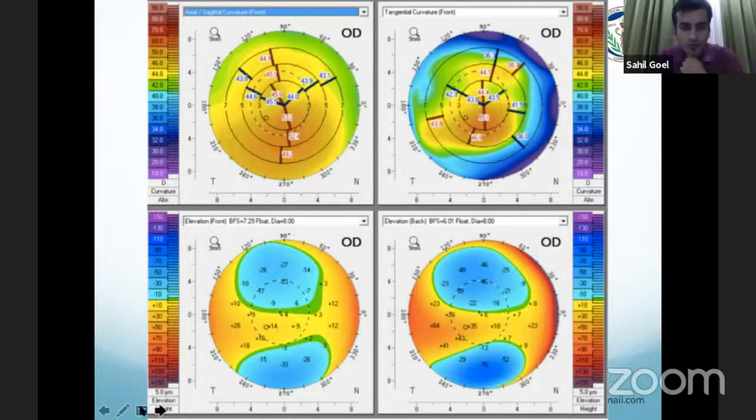So the cutoffs used, say, generally in Pentacam, would vary from machine to machine. Generally, the cutoffs used in Pentacam for the anterior best fit sphere would be 15 microns, for the posterior would be 20 microns. Pentacam and Galilei probably differ in this way: Galilei generally advocates in its indices that the toric aspheric is a better reference surface, that it increases the sensitivity to pick up keratoconus, while Pentacam essentially relies on the best fit sphere, or, as I will be showing, an enhanced ectasia reference surface.